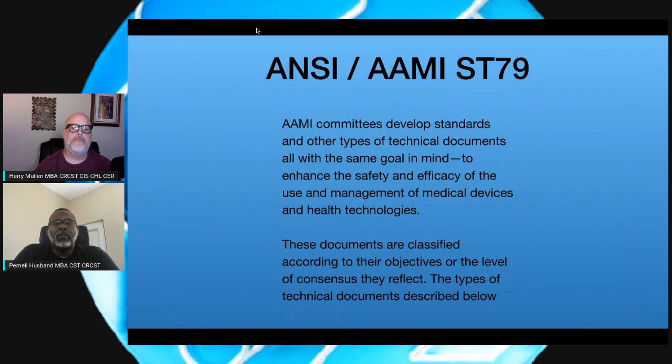Let's talk a little bit about committees. AAMI operates largely by committee, groups of professionals working on a specific area to come up with either standards or information for users. AAMI committees develop standards and other types of technical documents, all with the same goal in mind: to enhance the safety and efficacy of the use and management of medical devices and healthcare technologies. These documents are classified according to their objectives or the level of consensus they reflect. The types of technical documents are described as follows.